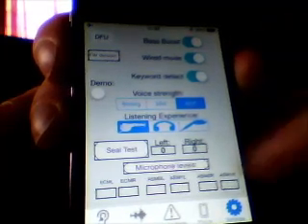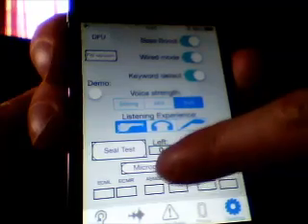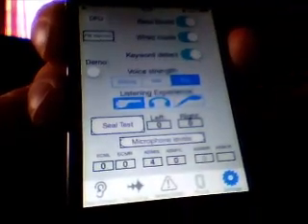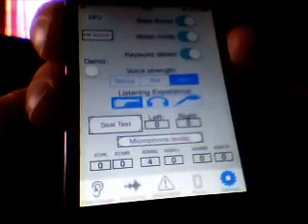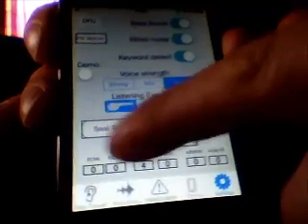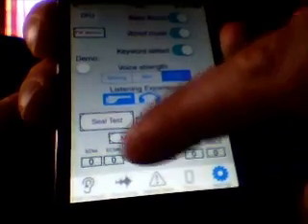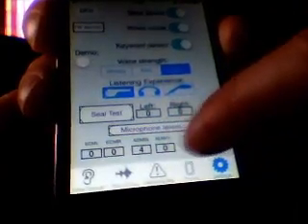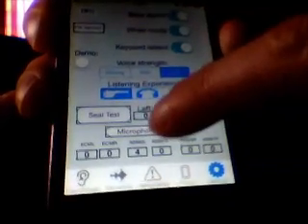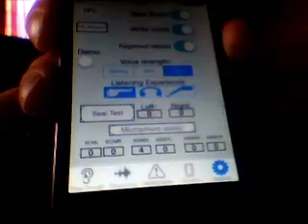And finally we have the microphone level switch at the bottom here. I press this and it will send a BTLE command to the earphone hardware, which will then return to the iOS app the level of the different microphone signals in the earphone. You can see it return mostly zeros here and a level number 4 there. If I press it again, it might display a different value. It returned all zeros. And that's the end of the app demonstration.